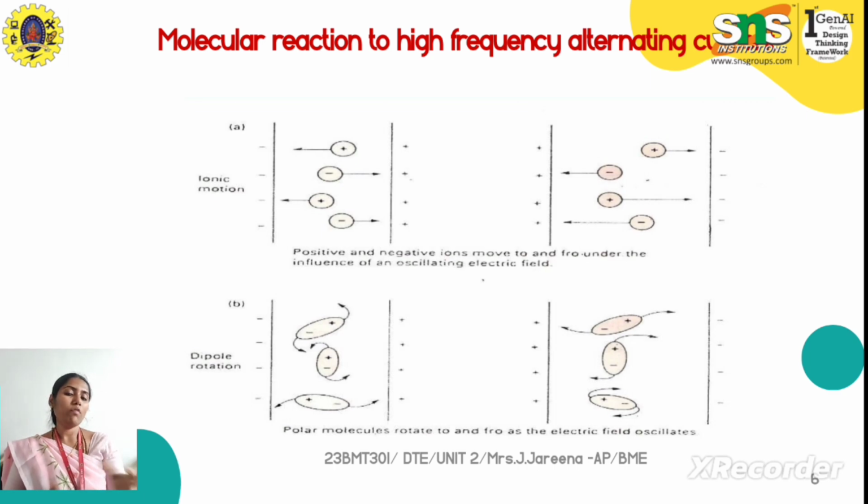That heating effect dilates the blood vessels to increase the blood flow. Once the blood flow is increased, you get cell nourishment, and other proteins present in the blood reach the targeted area for a repairing mechanism or treating effect. So this is the actual molecular reaction, under the influence of high frequency alternating current, that produces heat inside the body to promote the healing effect.